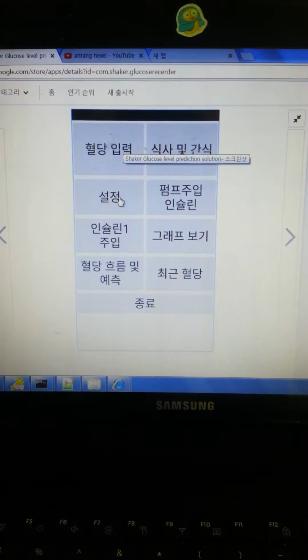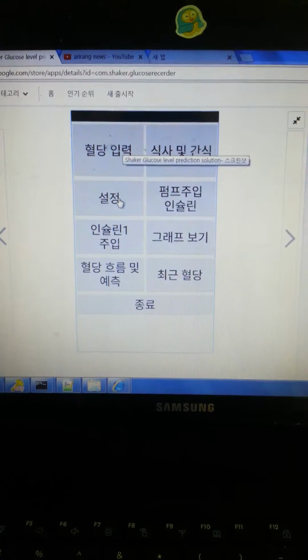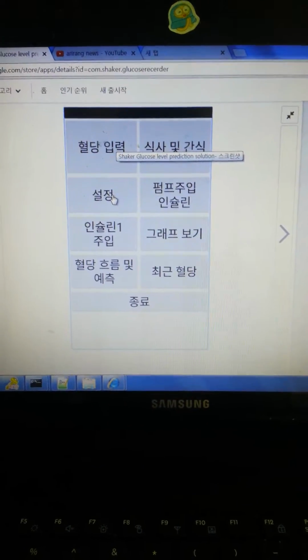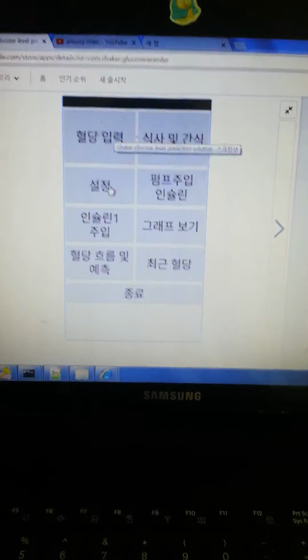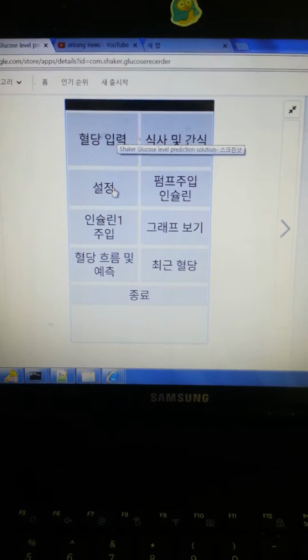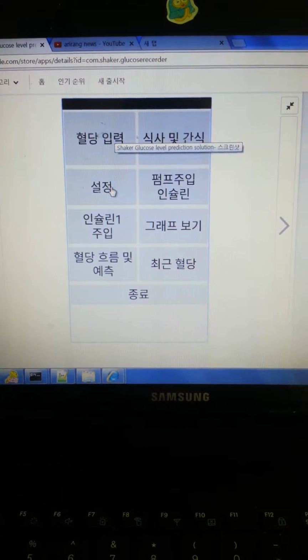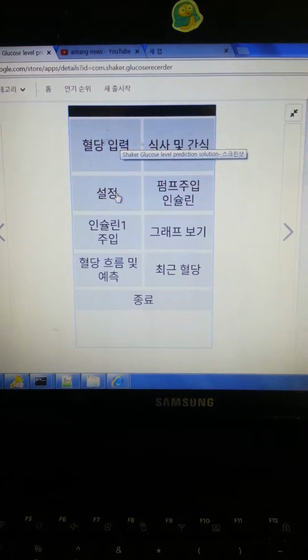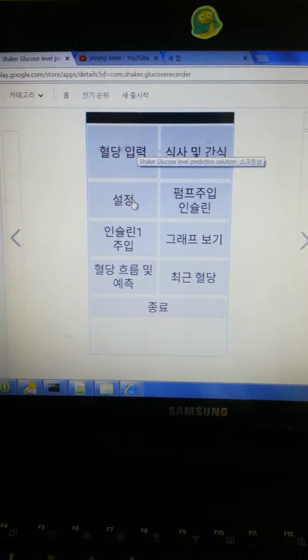When you have a meeting with other persons, this alarming may make your meeting not go well, and in sleeping time you may want to turn off the alarming.